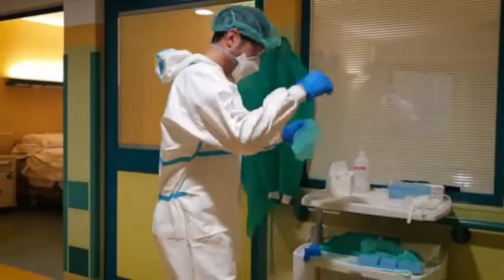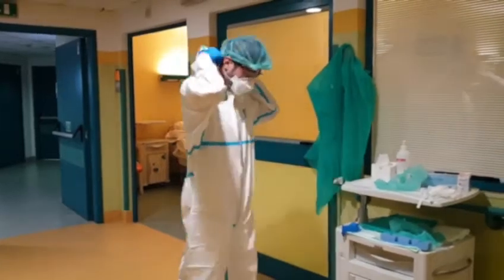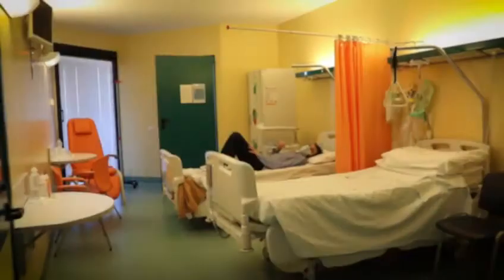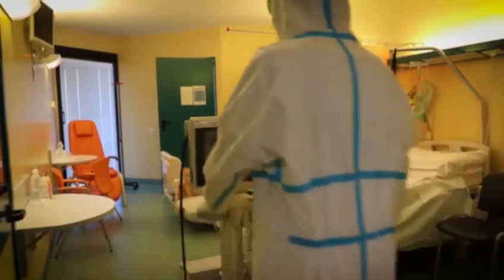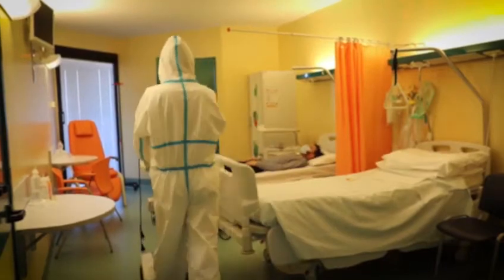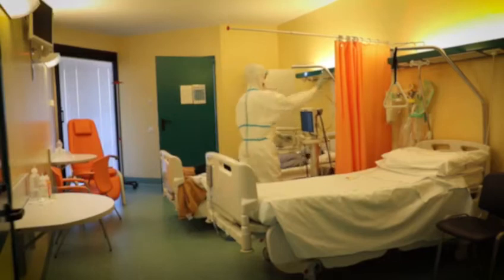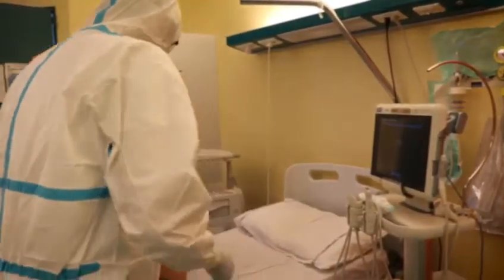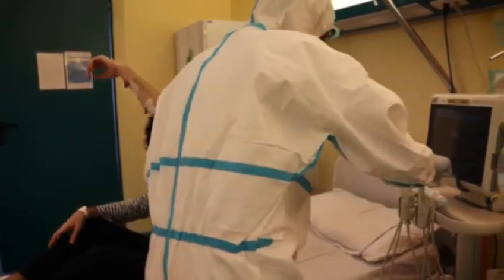In this video clip, we'll try to show how lung ultrasound can be a very useful tool to assess the presence of morphological changes indicating the involvement of lung interstitium in a patient symptomatic for respiratory distress with suspected COVID-19 infection. Basic lung ultrasound can be easily performed at bedside, even in the emergency setting. It is non-invasive, repeatable, and reproducible, and has a relatively short learning curve.